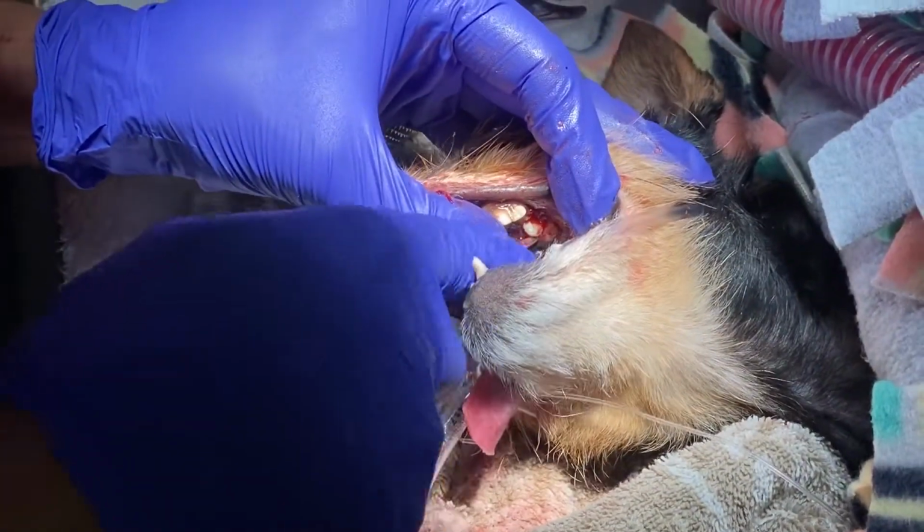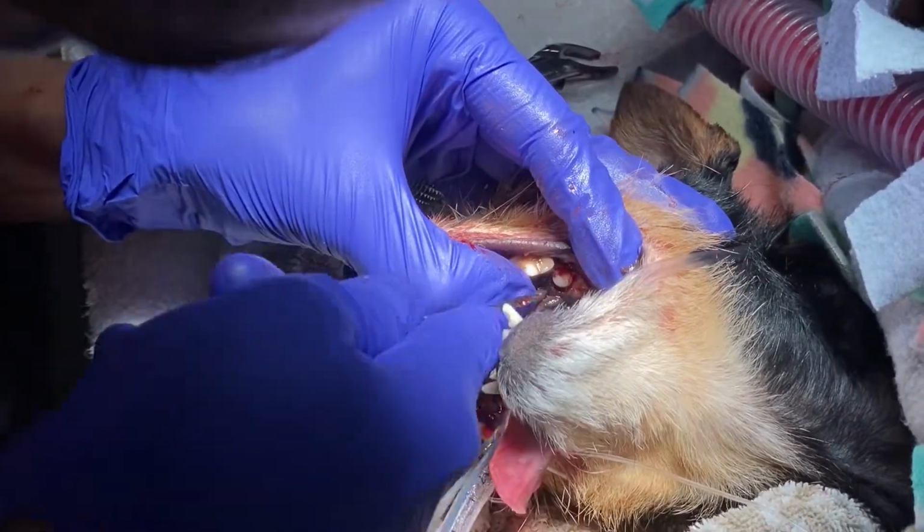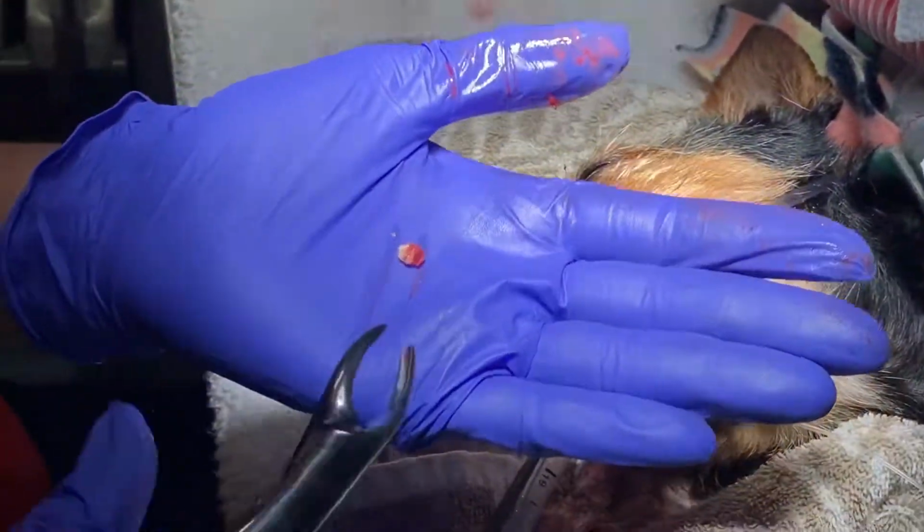Time getting in here. That's the last root.